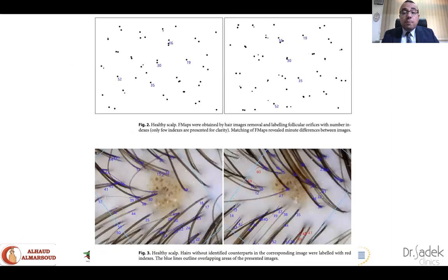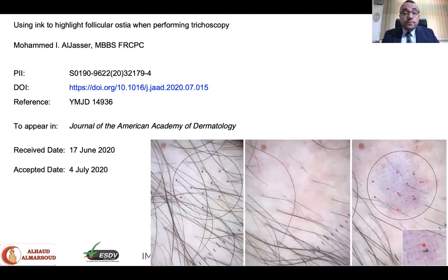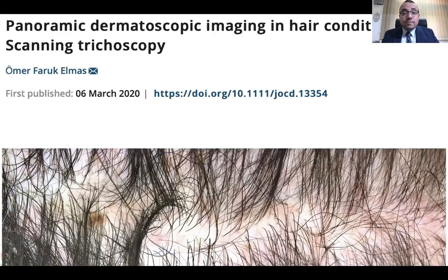And the one really interesting thing was the everlasting hunt for getting proper quantitative trichoscopy, and the introduction of the follicular map is really promising, whereby using high quality, high definition 70x magnification video trichoscopy, we can really detect the appearance of the hairs, and we can know exactly which part of the individual scalp it is, which shows no repetition over the scalp of any given individual or between individuals. And if you can't go for that, you can simply go for some ink, which will highlight the follicular ostia.